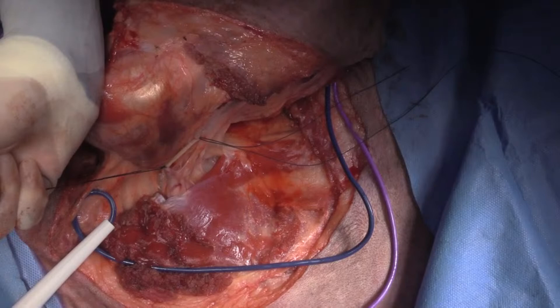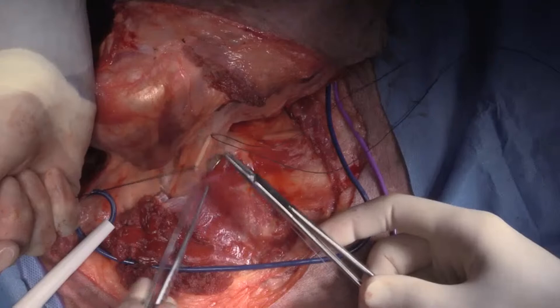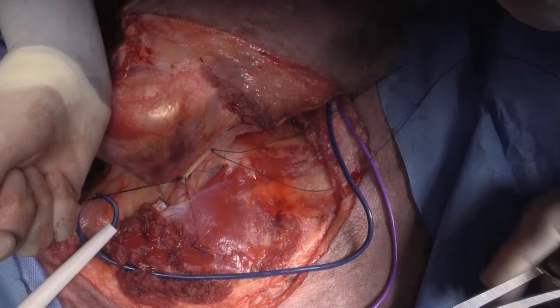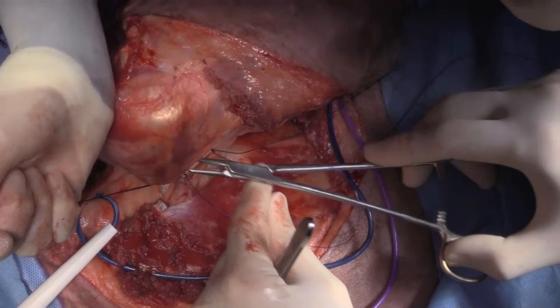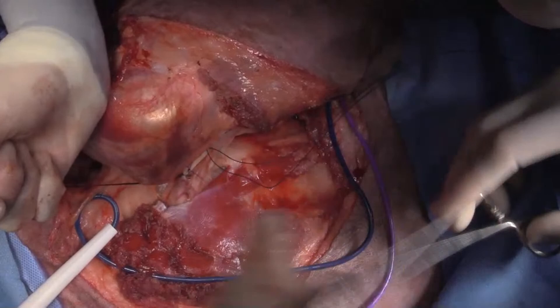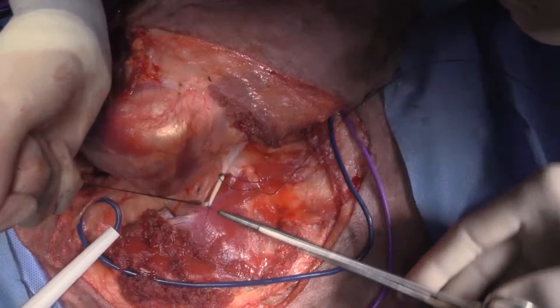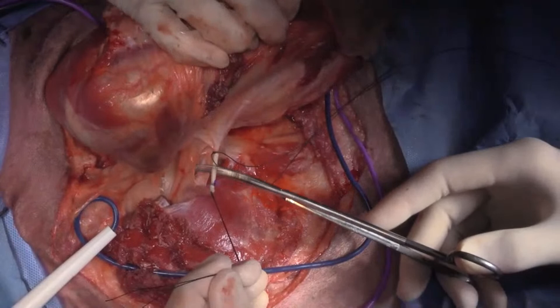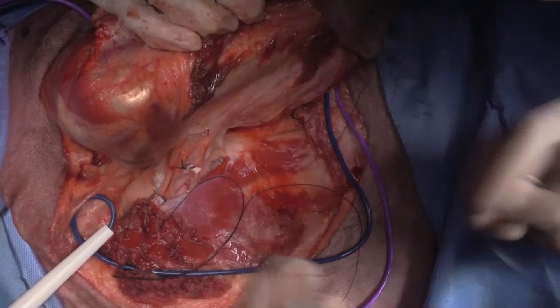So I've got some 2-0 PDS and I'm just putting it through the vessel, doing a knot — so that's my transfixation ligature. I'll come out here and cut the vessel, cut my sutures there. And then for my next trick, we're going to inject some of these nerves before we cut them.